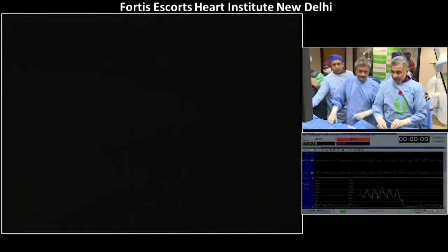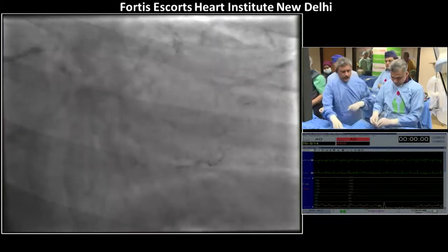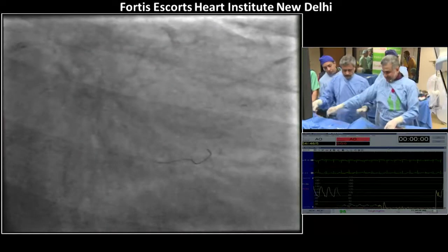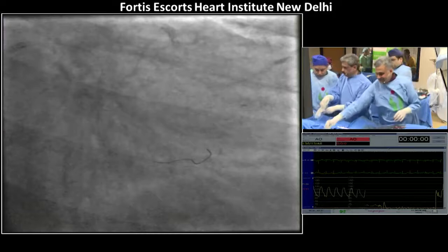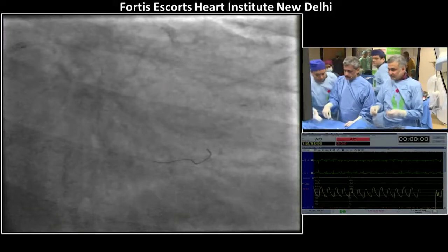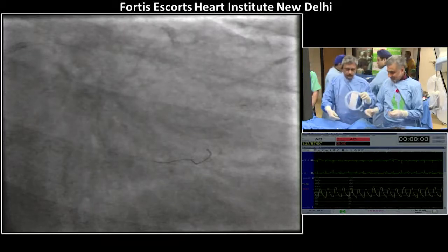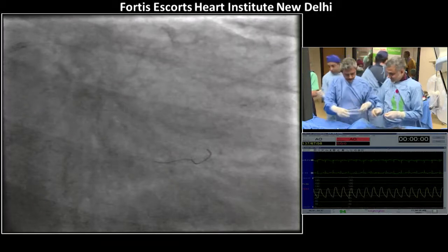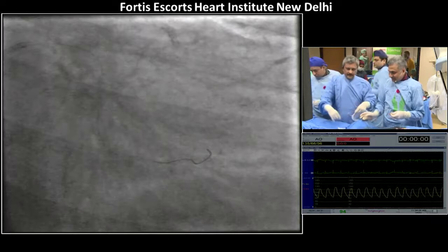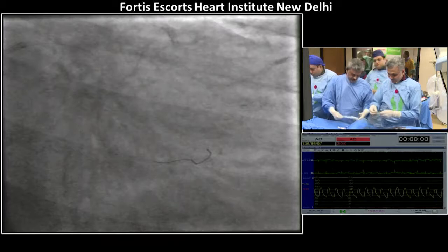Anybody in favor of a cutting balloon? There is significant fibrosis, but it is outside the stent. Well, you just implanted the stent, so I think you should be okay. You can use a cutting balloon, but I don't think that you need to at this point. You want to stay well away from the edges, but at this point you're going to re-stent the outflow anyway, so make sure that you get the stent down and expand the prior stent. We have to be careful not to have a rupture. That's the most important thing. A 2.5 into 12, 13.